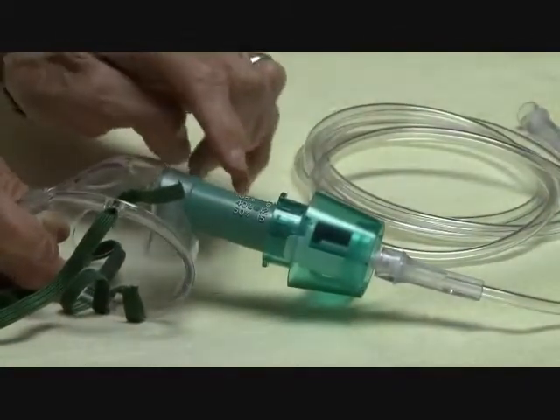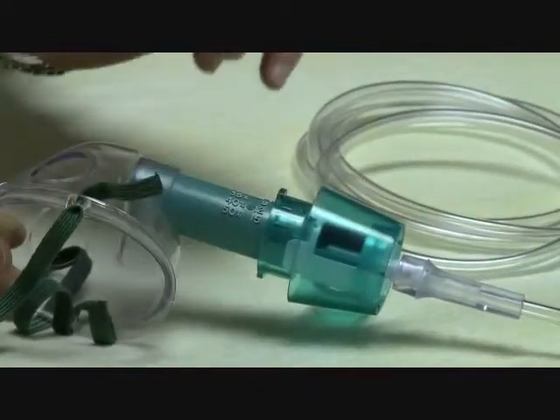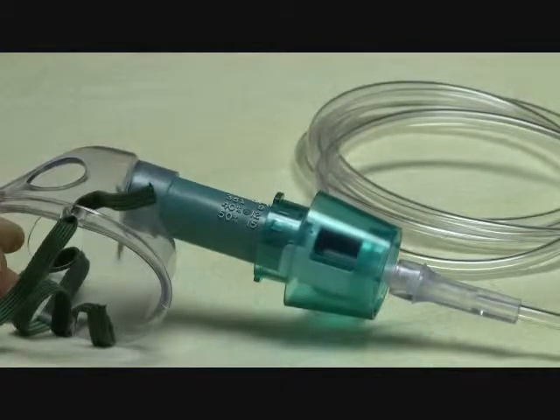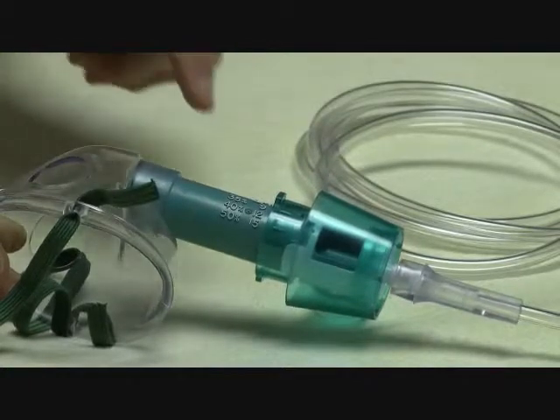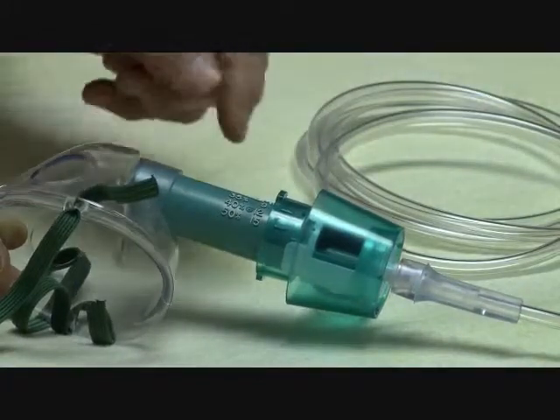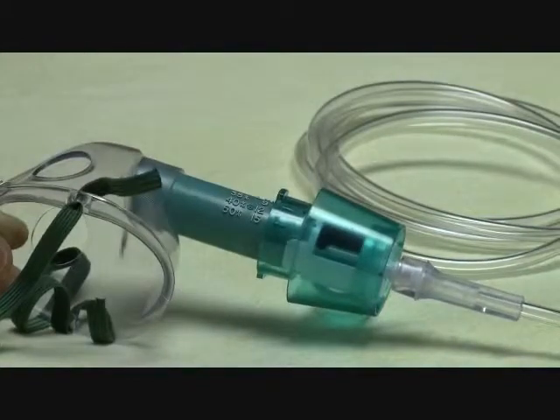Now you will notice that on the other side of these numbers of 35, 40, 50% is 9, 12, 15. Those numbers represent the liters per minute that you will titrate your flow meter to so that you will ensure that you are accurately delivering the appropriate amount of oxygen as labeled by your Venti mask.